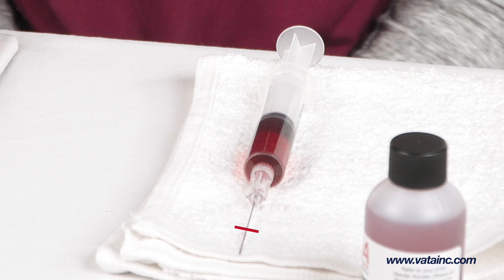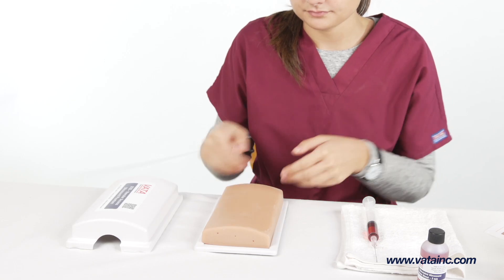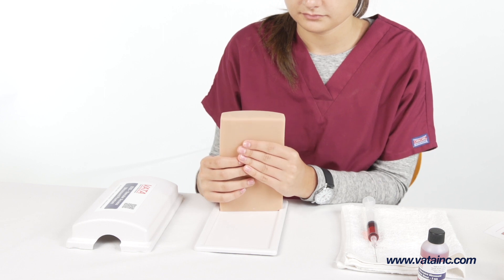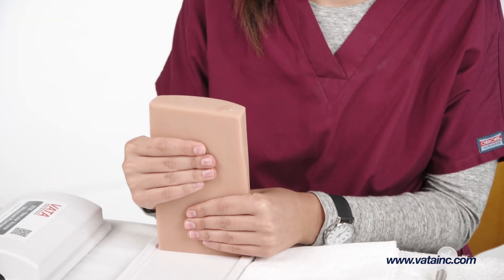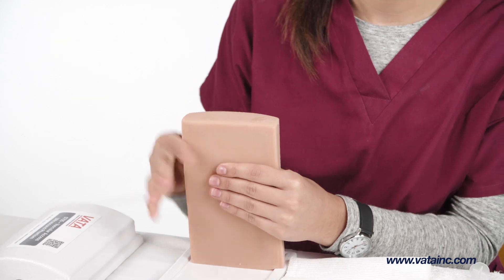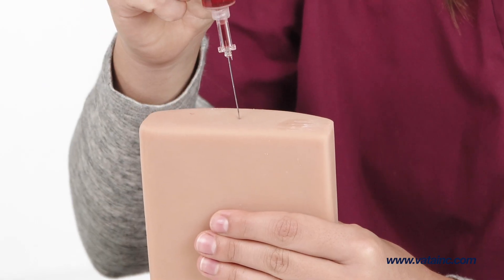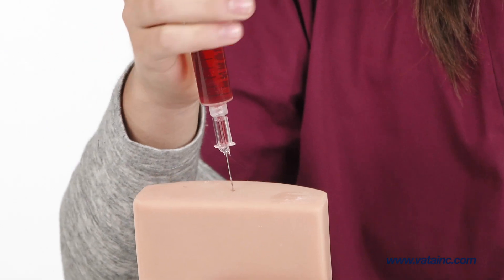Place a mark on the needle a half an inch from the tip. Place the phantom in a vertical orientation with the side that has three recessed dimples at the top. Gently tap the convex side of the phantom to move any trapped air towards the top of the vessel for aspiration.